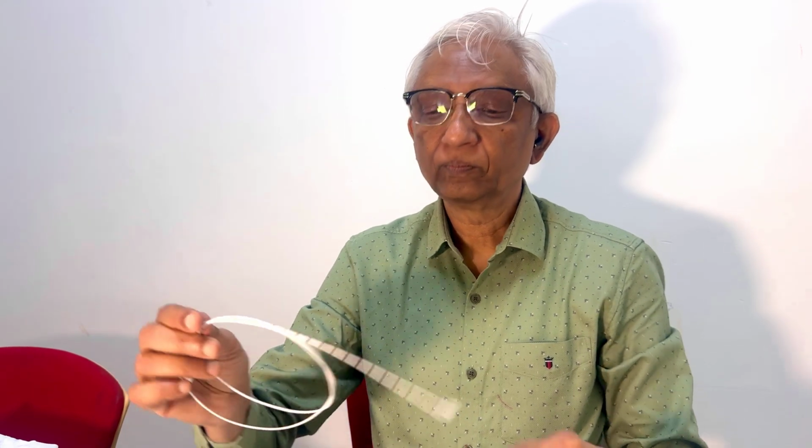So let's start with a common catheter we use. This is a pigtail catheter.